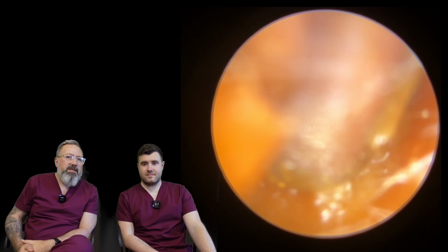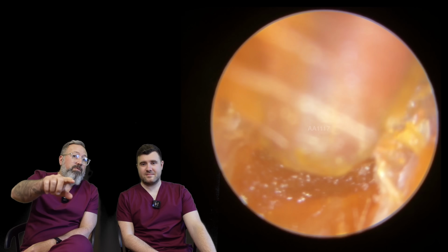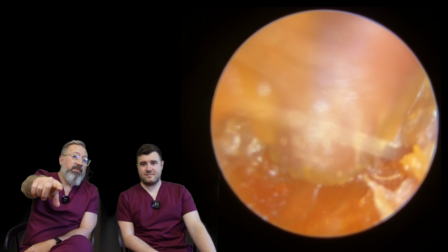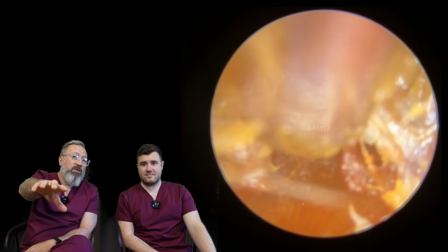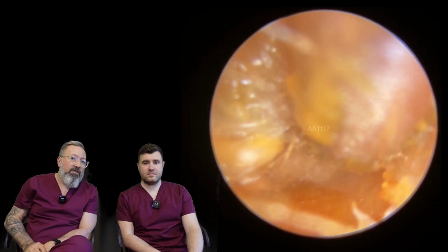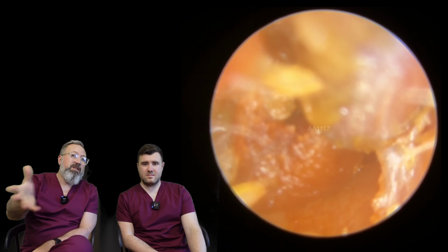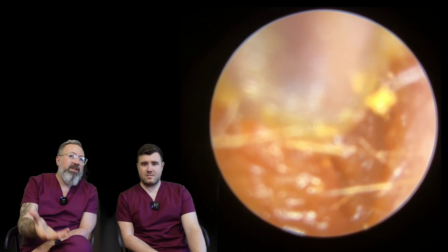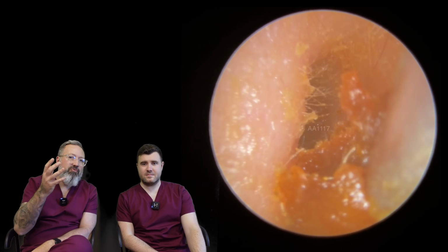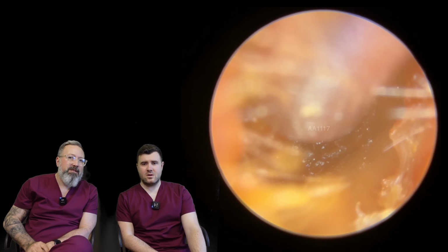I thought, oh my goodness, this is going to be a tough one to do if it's this consistency all the way through. But what we start to see in a second, as we get a bit further in, is it detaching from the canal wall a little bit more easily. We've got a mixture of dry skin and soft wax here at this entrance. You can see the flaps of dry skin coming off on the side, so you're acutely aware of clarinetting at this point, that high-pitched shrill whistle you get if there's a little bit of skin that flaps around in the end of the suction.